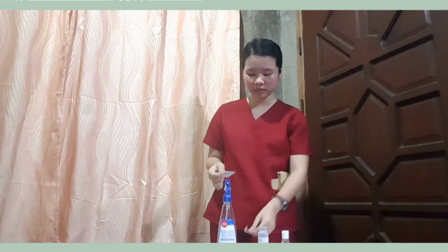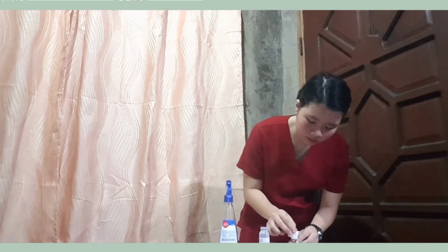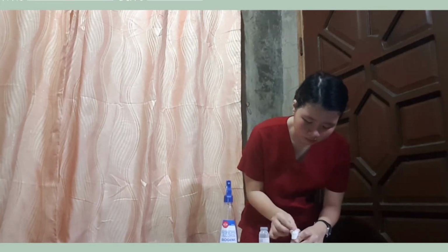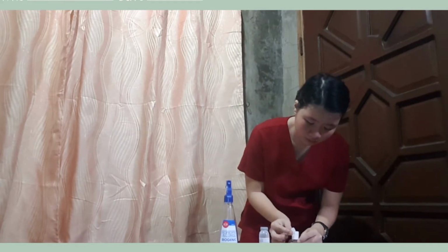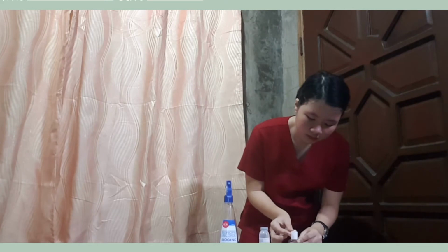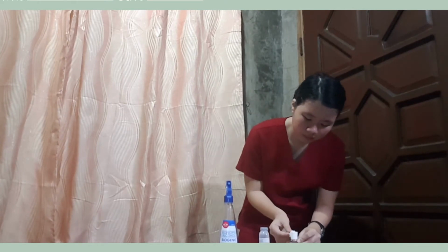And after 30 seconds, we're going to clean the other insulin using an alcohol. 30 seconds. And we're done. And now we're going to dispose the alcohol prep pad that we've used.